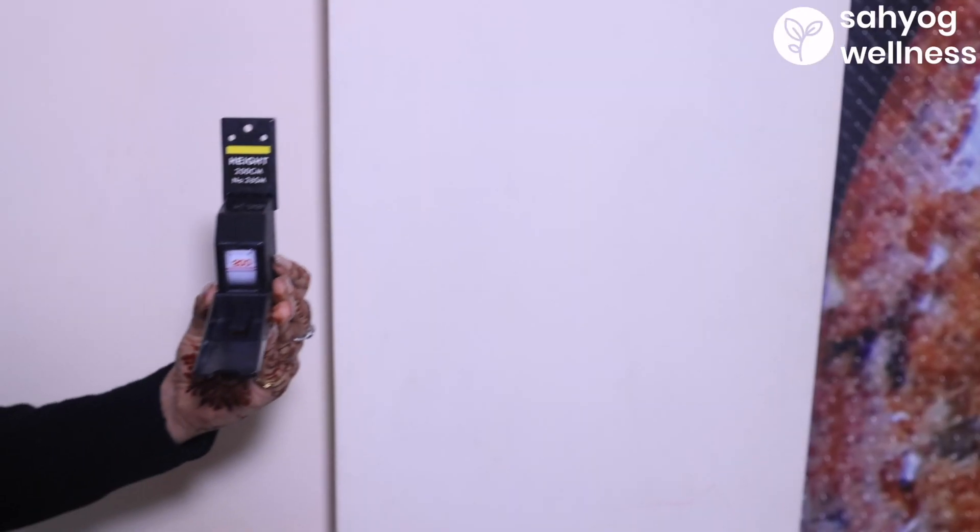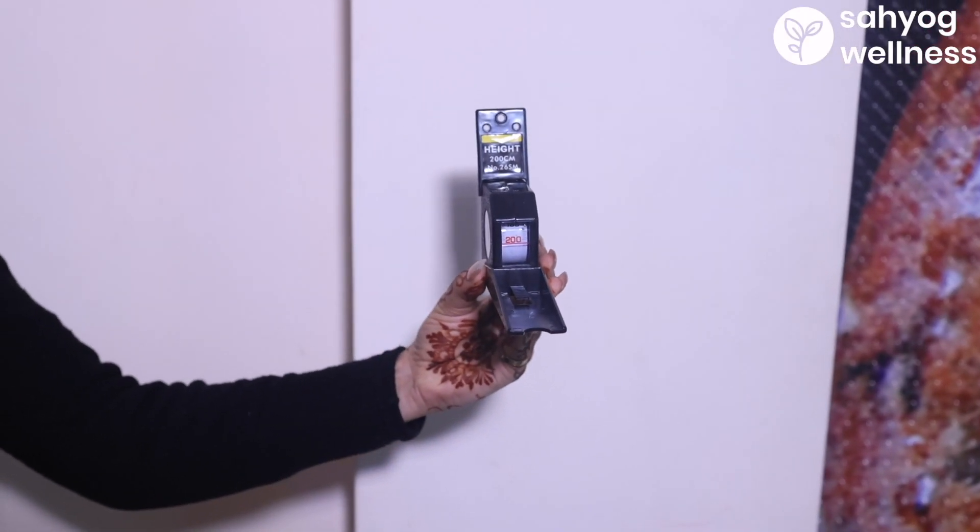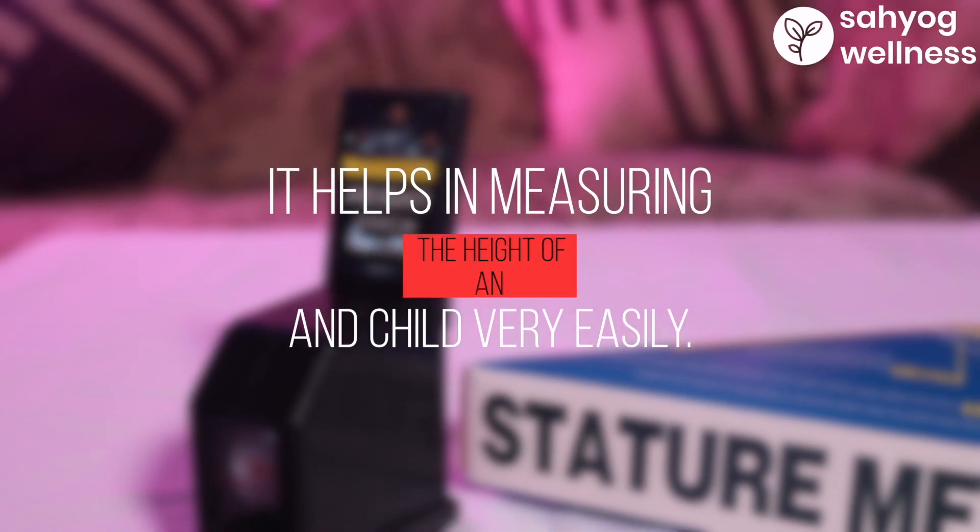Introducing the Sahyog Wellness Stature Meter. It helps in measuring the height of an adult and child very easily.